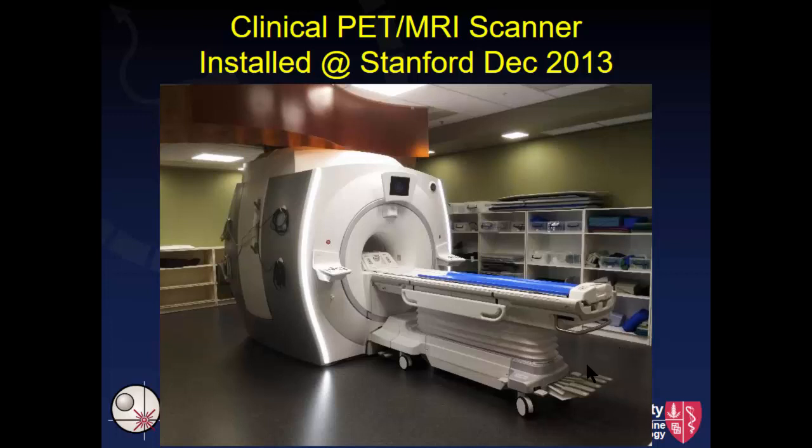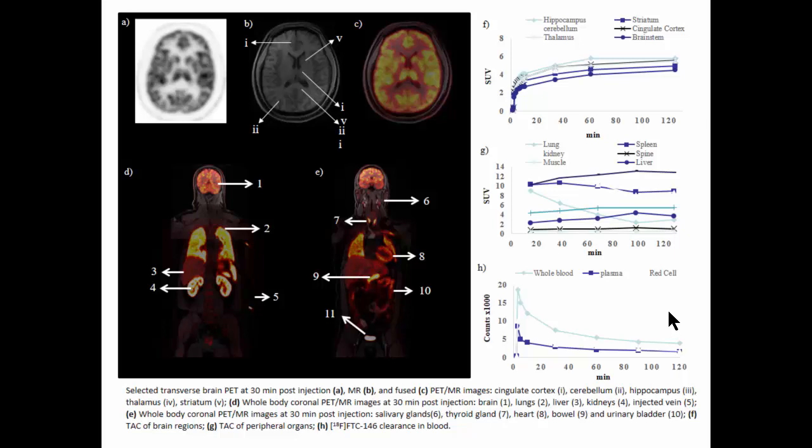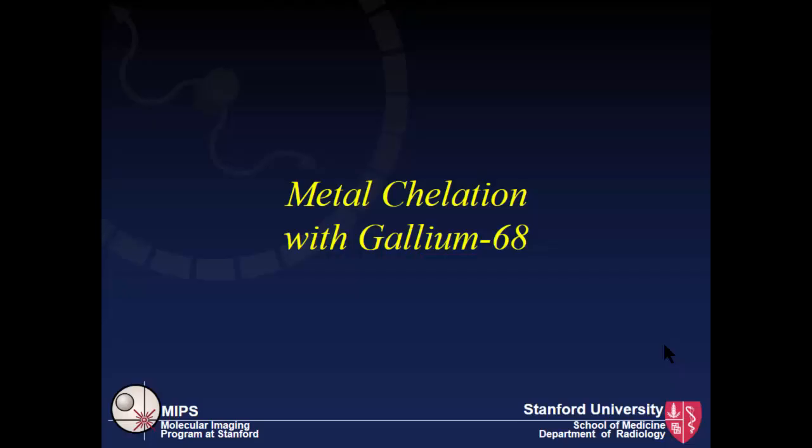Here's a picture of our PET-MR scanner that was installed in 2013, and these are our first images of our tracer in man, and the good news is that there isn't any bone uptake, so we're pretty happy that this compound did survive and is stable in humans.